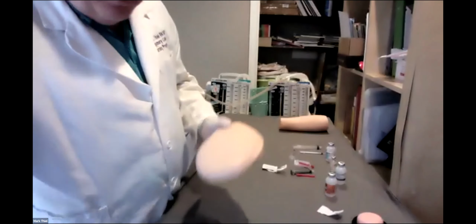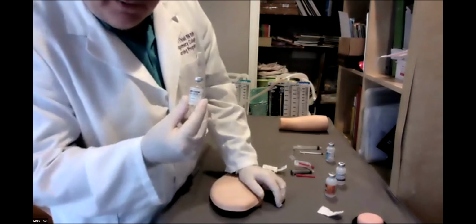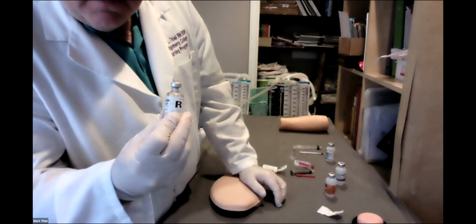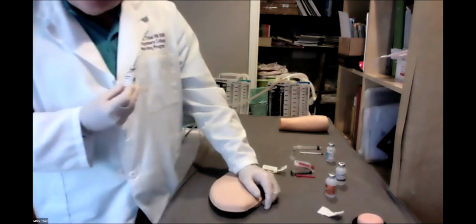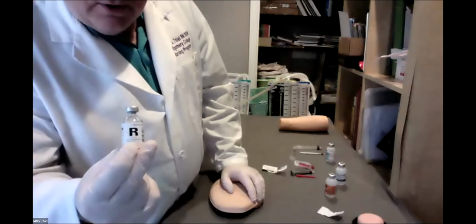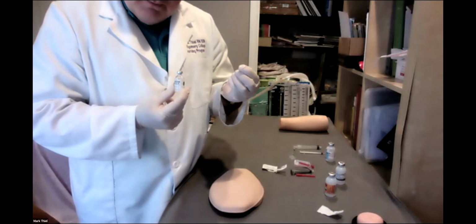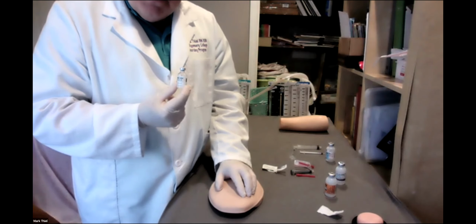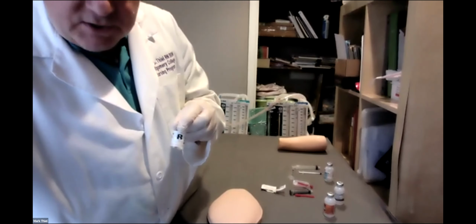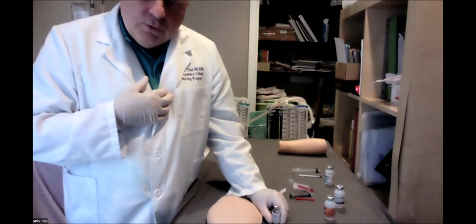Sub-Q. Today, we're going to be giving regular insulin as our subcutaneous demo. Nurse check. Am I giving regular? And once I draw, do I have the proper dosage? Right? You know, obviously, what is step one for an insulin injection is the test of the blood glucose via the glucometer.